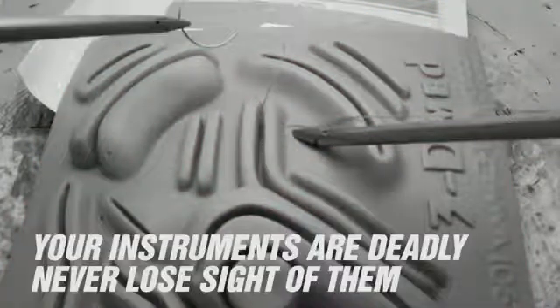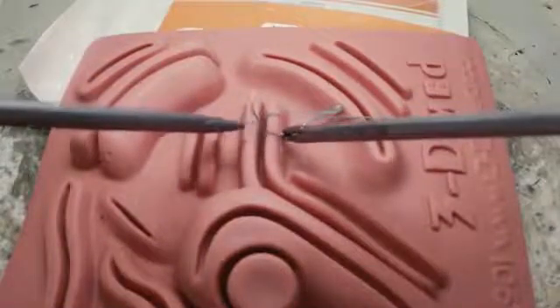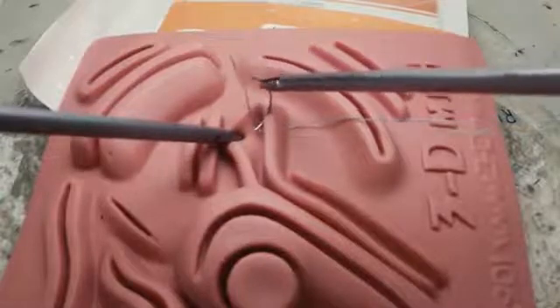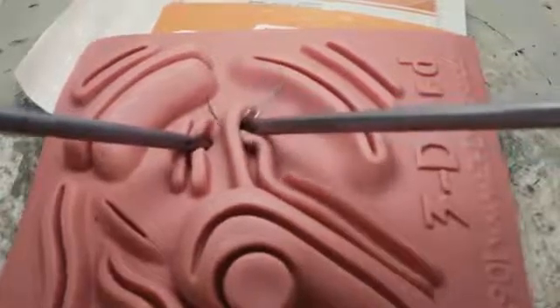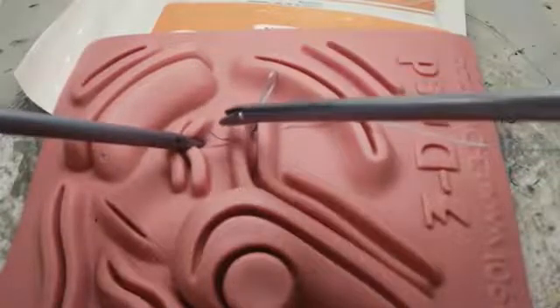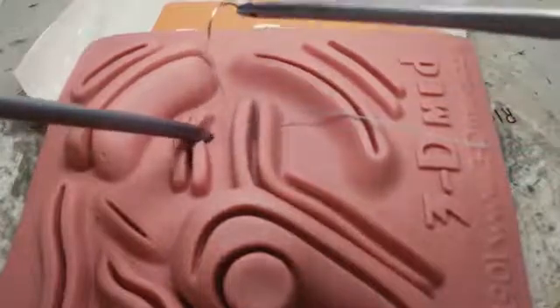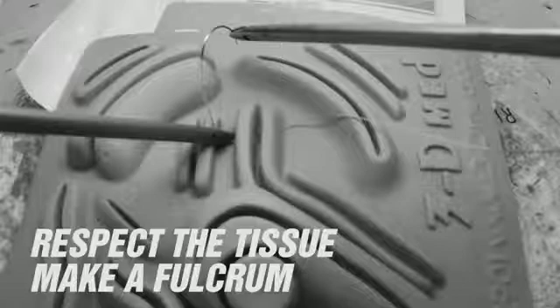It's important to keep your instruments in view at all times and minimize needle handling if possible. Trust the needle left in the tissue. Bring the needle through by supinating your right hand. Make a fulcrum with your left hand to avoid traumatizing tissue as you pull through.